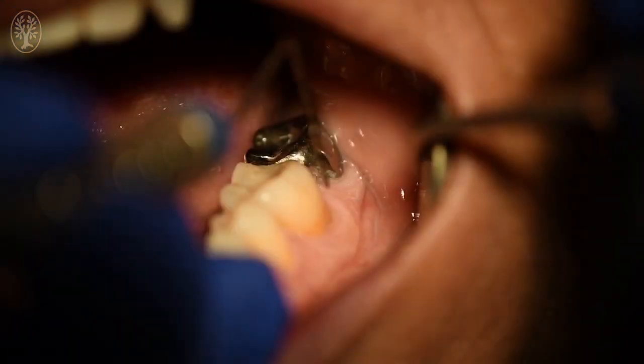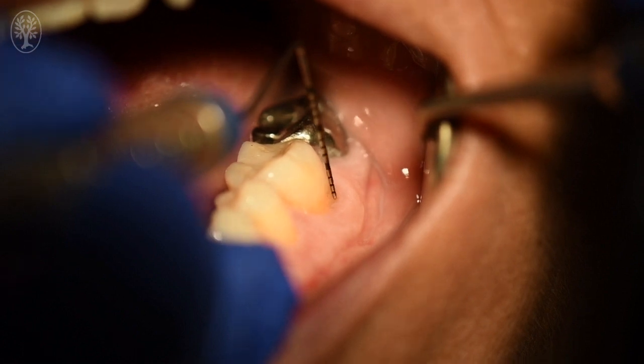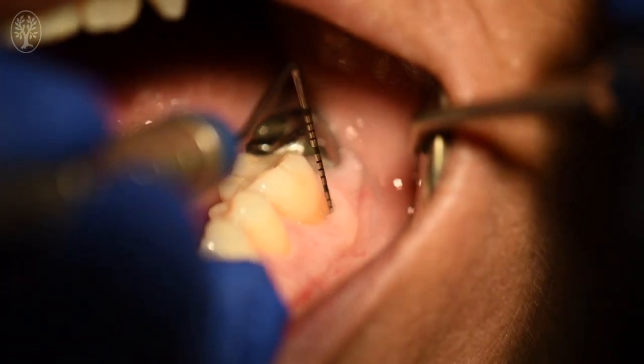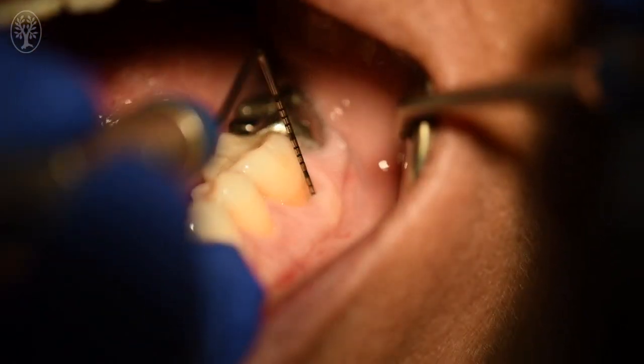Here is a clinical view of the clinical attachment level in an area with gingival recession. Here is the cement-enamel junction. Here is the gingival margin with a distance of the cement-enamel junction to the gingival margin at 2 mm. Now the probe enters the sulcus, which is a little more than 1 mm deep, so 2 mm rounded up as probe depth. So the clinical attachment level here is 4 mm.